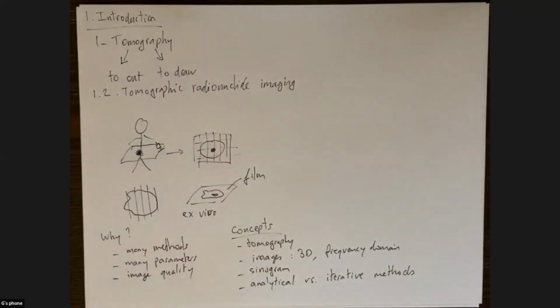All right, I just want to go briefly. So, we talked about images during the video. Images is a stack. A 3D image is a stack of 2D images, and each image is a 2D array of pixels.